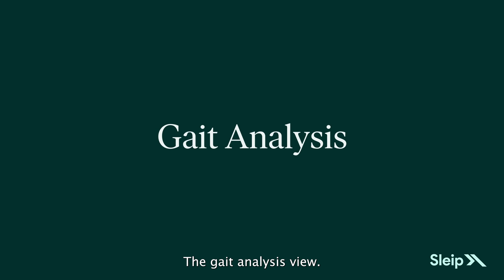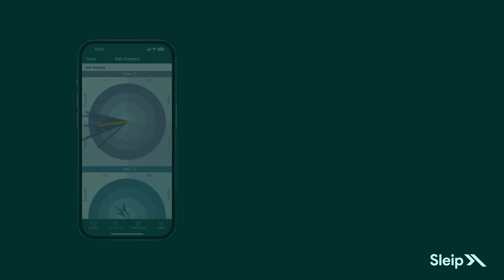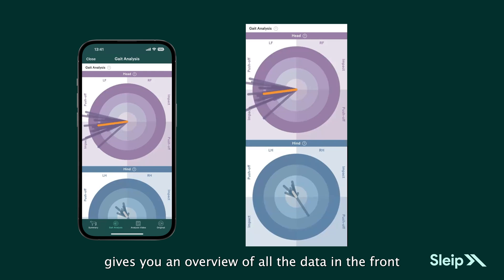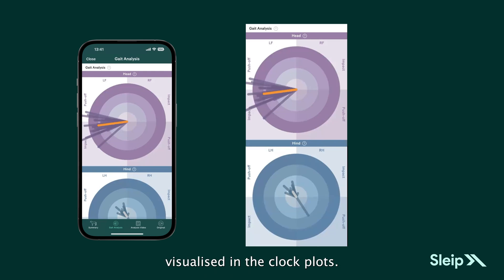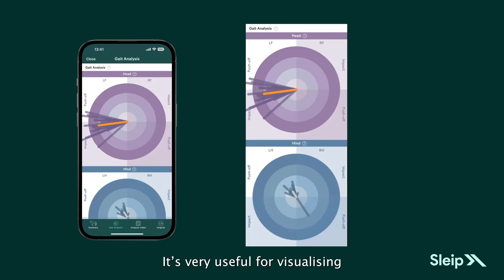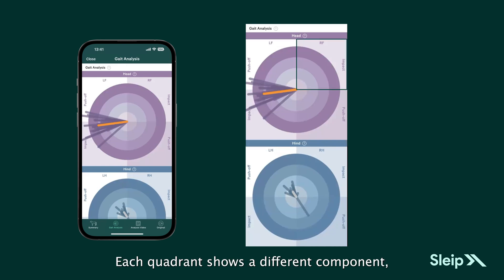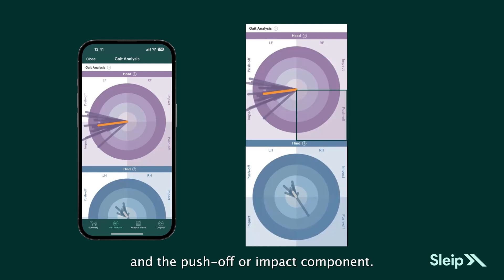The Gait Analysis View gives you an overview of all the data in the front and hind limbs, visualized in clock plots. It's very useful for visualizing the consistency of the asymmetry, which is of clinical importance. Each quadrant shows a different component, indicating the limb and the push-off or impact component.